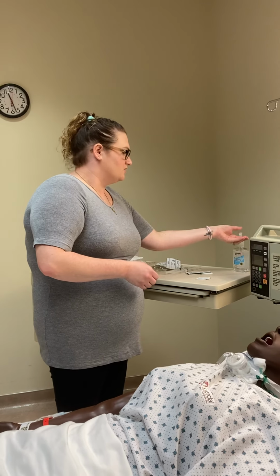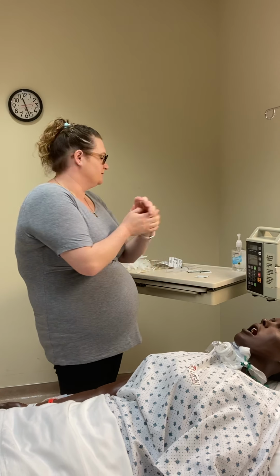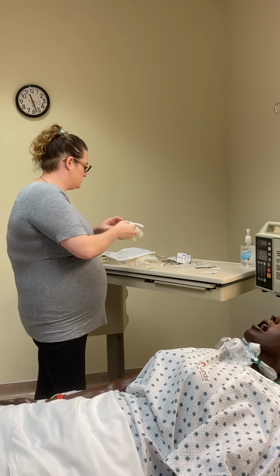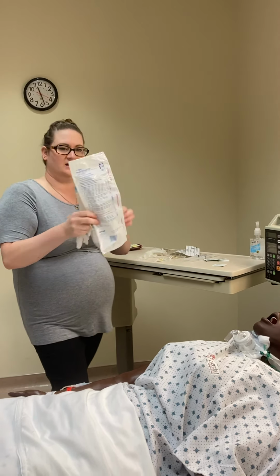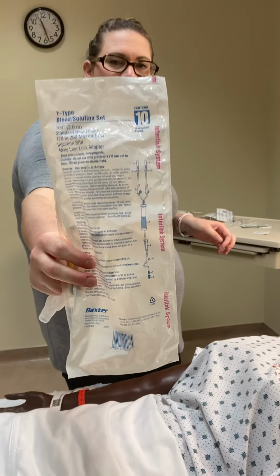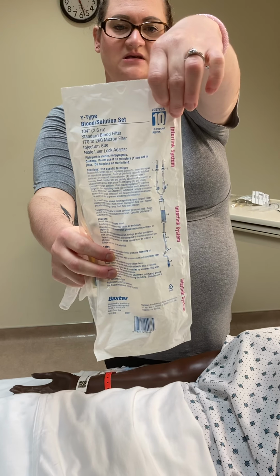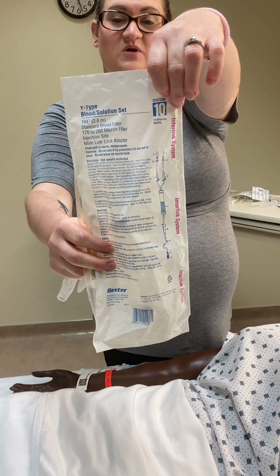Just so you know, the tubing that comes in your totes does not fit in our Baxter pumps. So when you come in for practice and for testing, you will actually be doing it by gravity. So I'm going to do it that way. All right, so I need my Y tubing, and we see in the corner that it says it is approximately 10 drops per milliliter here.